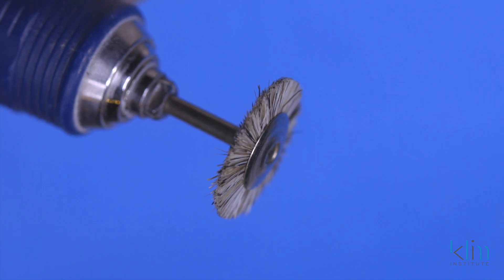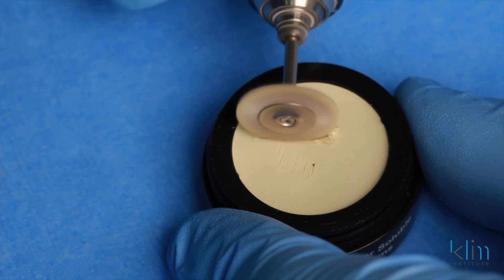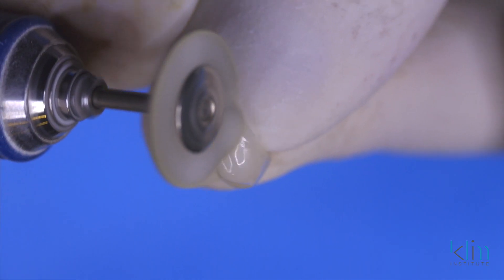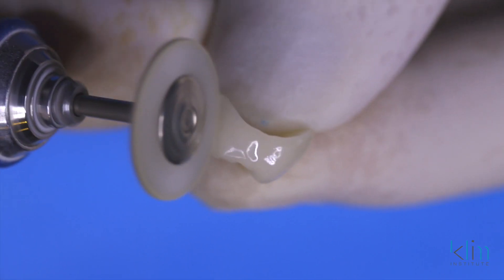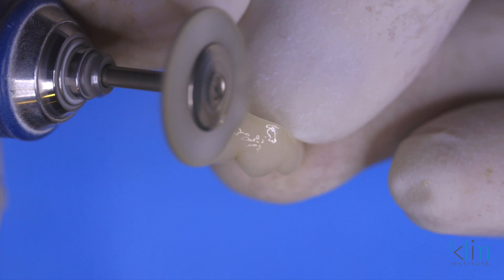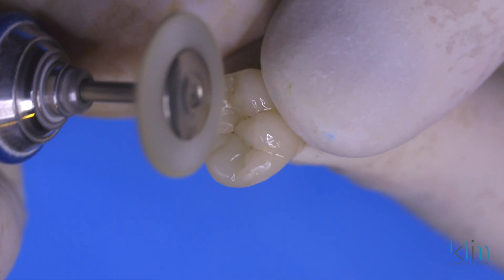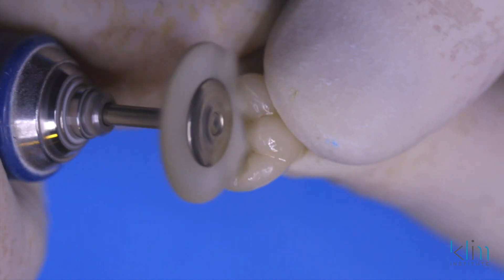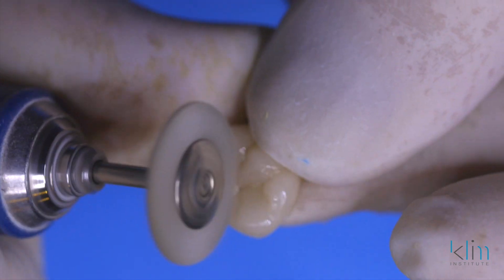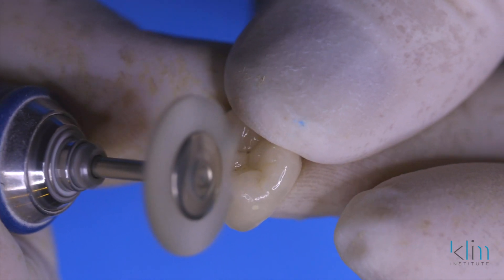Microscopically, that occlusal table is still rough with the glaze. We're going to take a stiff Robinson wheel with a diamond paste and smooth off those microscopic tags. I like to polish the whole surface of the restoration — the main reason is to keep a smooth surface, particularly posteriorly, so it discourages biofilm collection due to surface texture. On that occlusal table, we want it smooth so it wears appropriately to the opposing dentition. When we're using that stiff Robinson wheel, we plunge and release — that allows the bristles to release and get a complete polish at the depths of those pits and grooves. A good diamond paste, a stiff Robinson wheel, and a plunge-and-release technique is very effective for polishing down to the depths of the grooves.